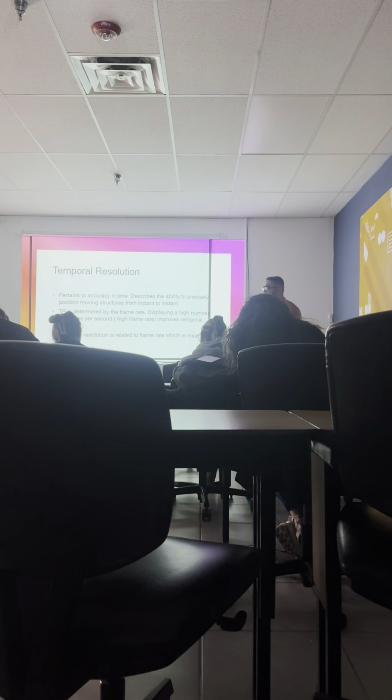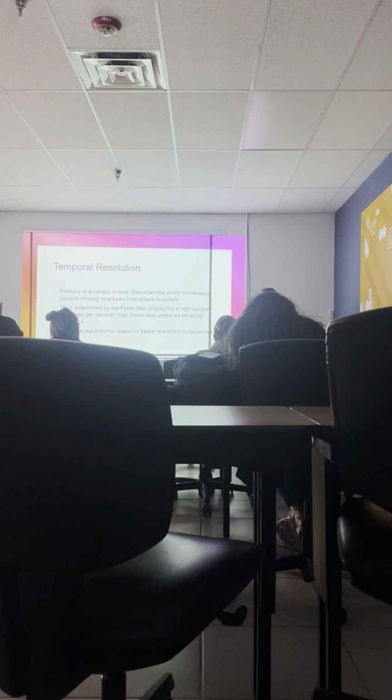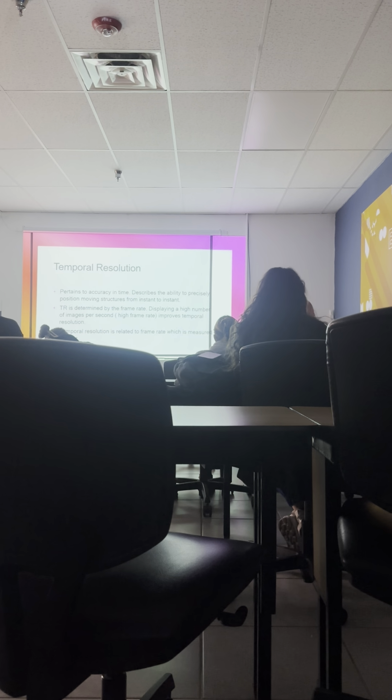Temporal means time, right? Yes. Okay. So, temporal resolution pertains to the accuracy in time. That means it's the accuracy of showing a structure that is moving.